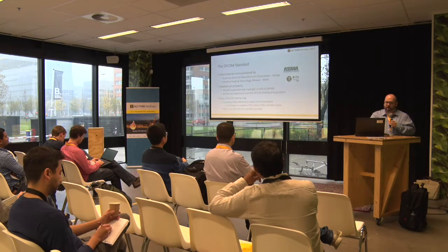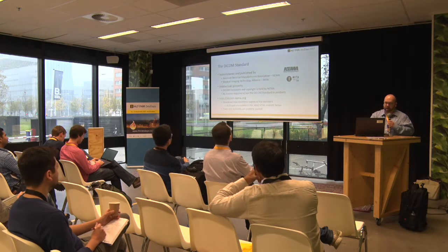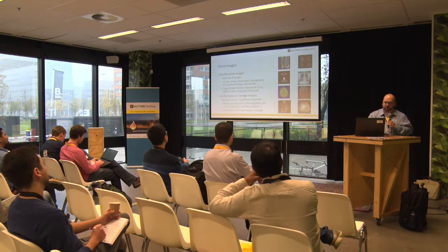It's administered by NEMA, the National Electrical Manufacturers Association, along with MITA, the Medical Imaging Technology Alliance, and you can just go to dicom.nema.org for more information.